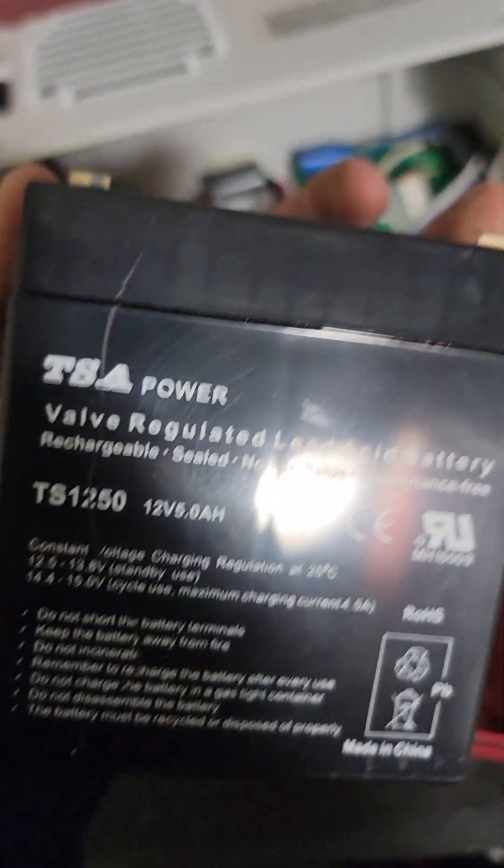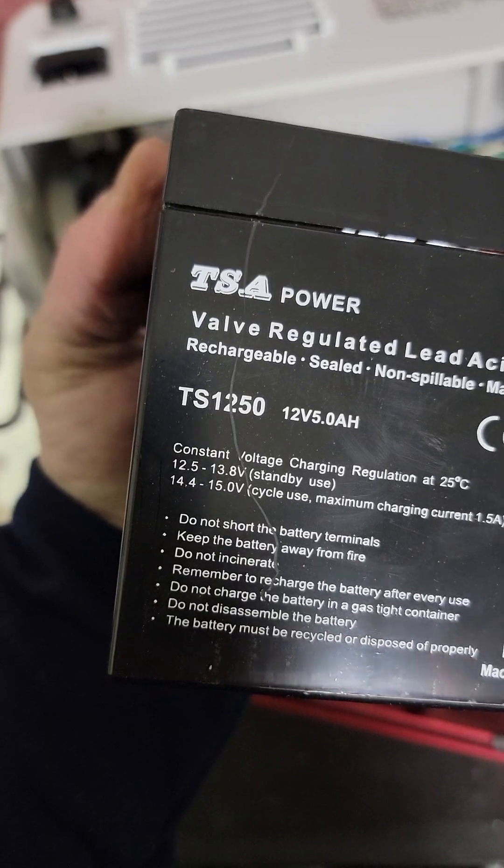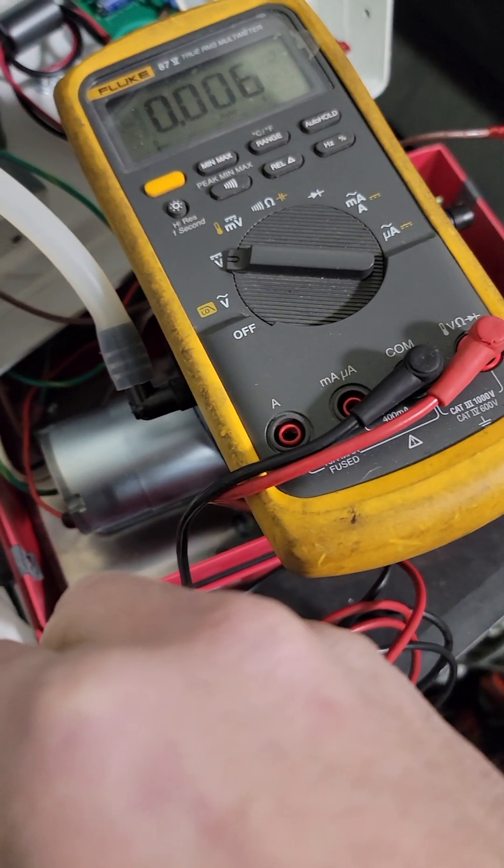There's our battery — 1250. What are we looking for? Roughly 12 to 15 volts. Got our Fluke 875.